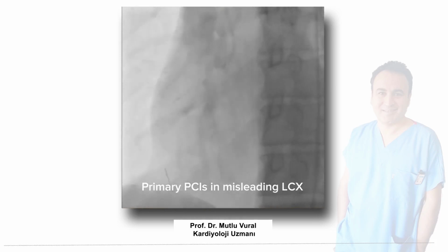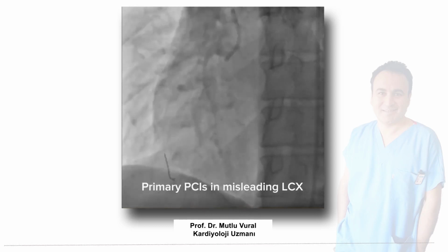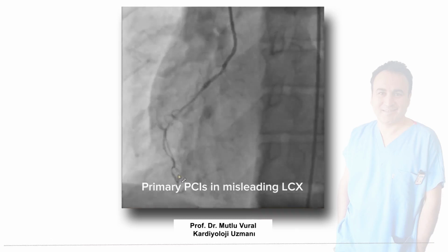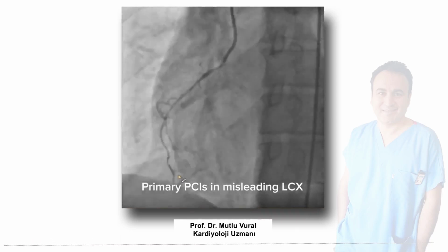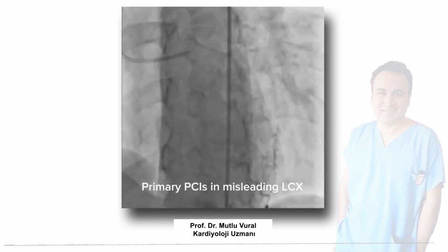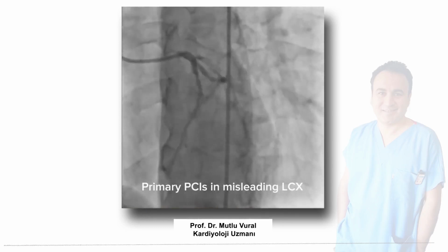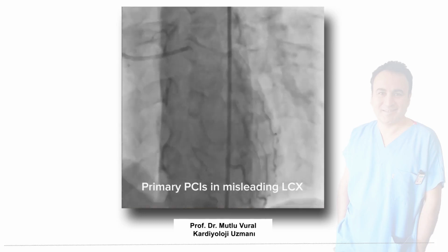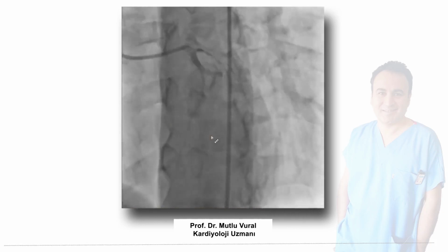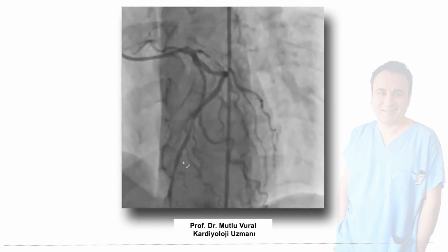We crossed the lesion, but a normal balloon couldn't be delivered to the lesion. We used a CTO balloon. This is a 1.2 millimeter balloon. But we realized that it was a non-dominant RCA. And we tried to check the coronary anatomy because the RCA shouldn't be the guilty lesion. And we realized that there is overbranching in the dominant circumflex artery, and there may be total occlusion in the distal circumflex.